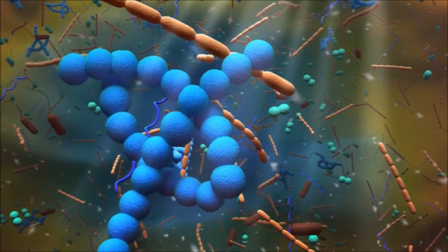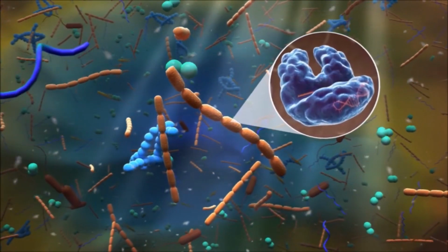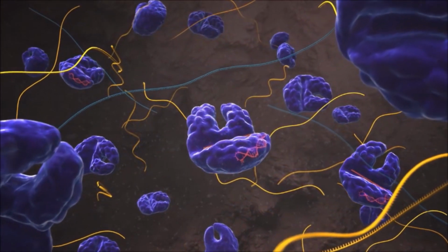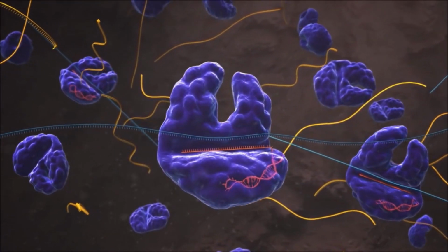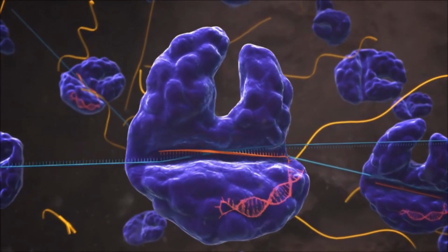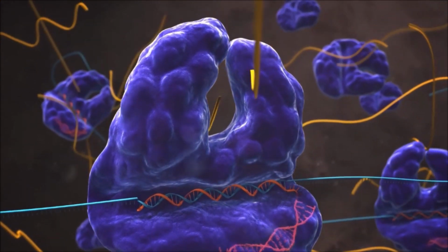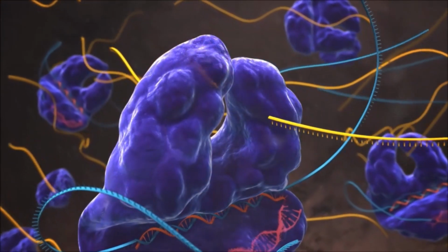A team of scientists found that a cousin of Cas9 called Cas13 can be harnessed to actually detect human disease. Here's how Cas13 works in its natural environment. First, it hunts for viral RNA using an RNA guide. When it finds its viral target, Cas13 becomes activated. In some circumstances, it cuts any RNA it encounters, a process termed collateral cleavage.